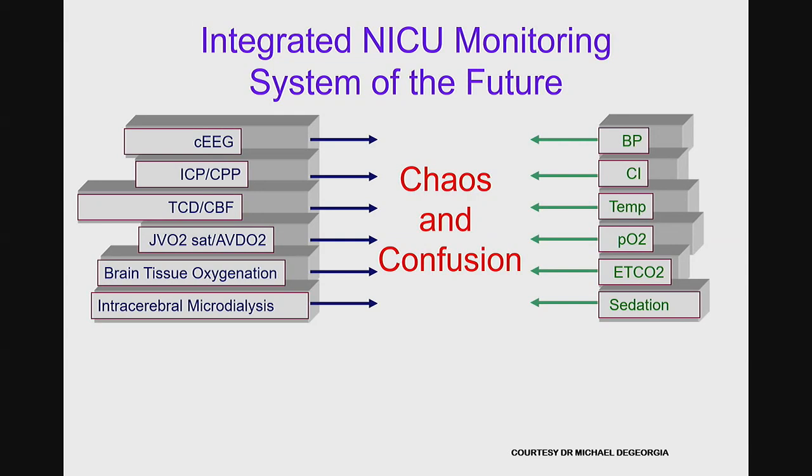So there is emerging technology to do that now, and the most commonly used commercially available one is called the Moberg CNS monitor. Some ICUs build their own systems. We just installed a platform called SickBay, which is a virtual data aggregator that lives on hospital servers inside the firewall that can grab and collect and permanently store forever all of our physiologic data.